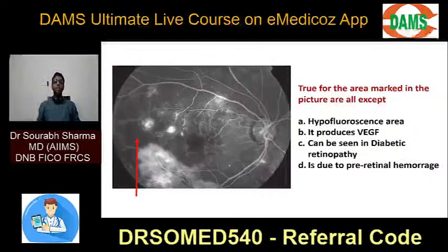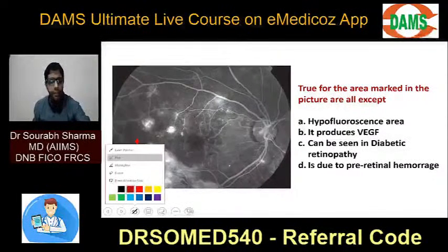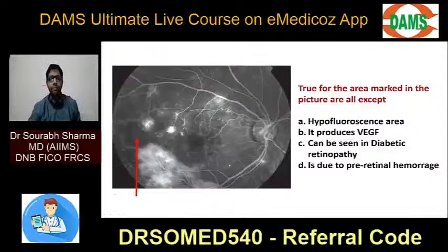Now, can you answer this question? Image-based question. I have marked the area in the retina. First, tell me this is right retina or left retina. That everyone knows. This is the right retina. No issues in that. The area marked. What is true for the area marked? Except.